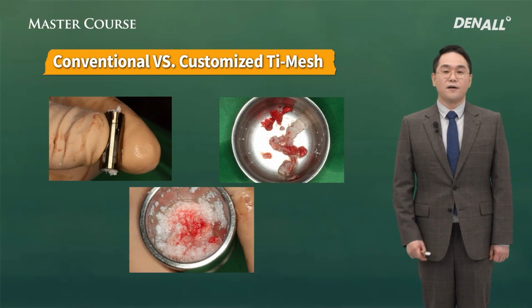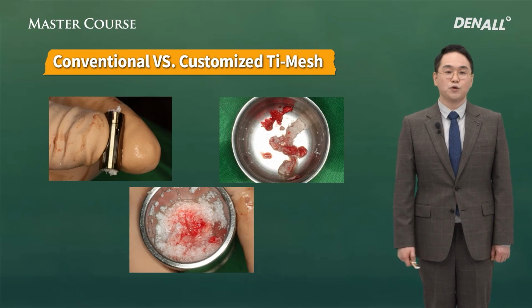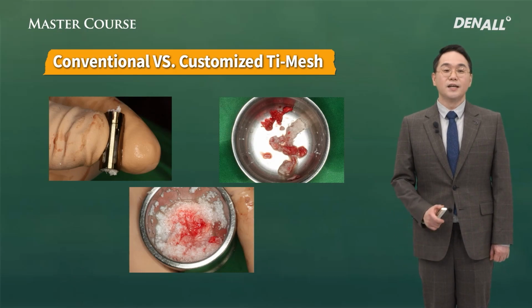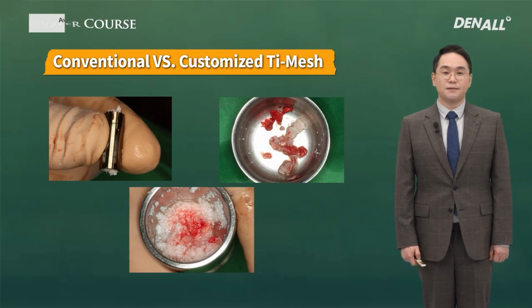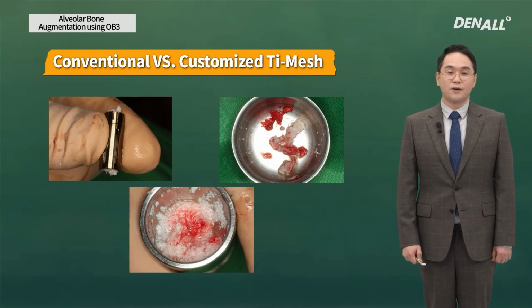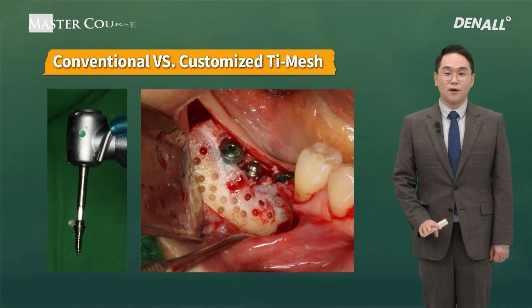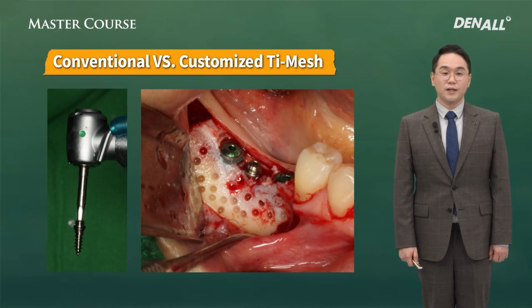Using an auto bone collector from the ramus distal to 47, from the buccal area, autogenous bone is harvested and is mixed with xenograft material at a 1:1 ratio between number 46 and 47 implants. The tenting screw is placed to connect to the Jawbuilder.